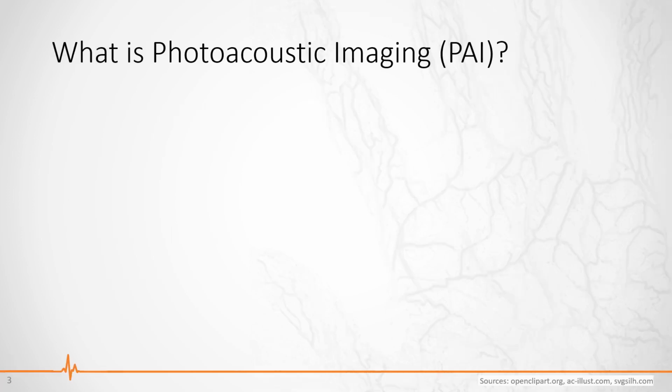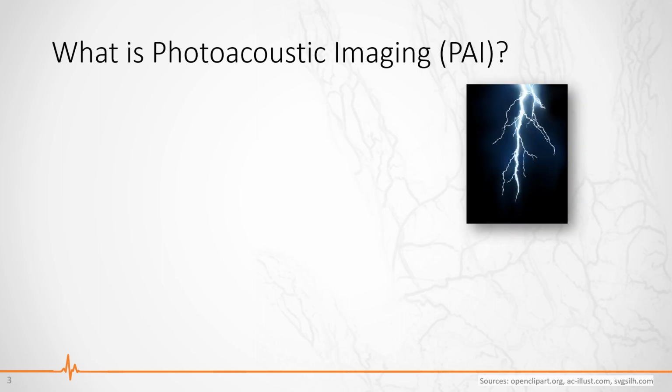What is photoacoustic imaging? As the name already implies, it is an imaging technique based on light as well as sound waves. This has some inherent advantages because the two types of waves behave very differently in media. One very basic example of photoacoustic measurements that you probably all know is for locating thunder.